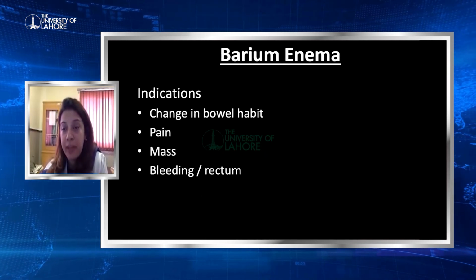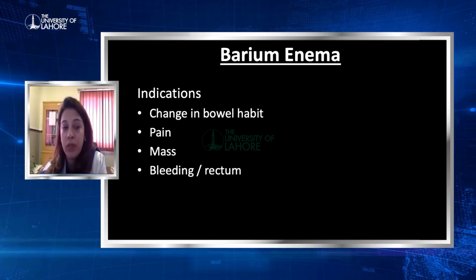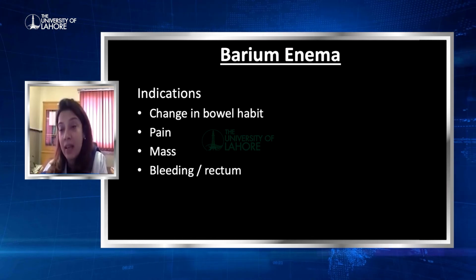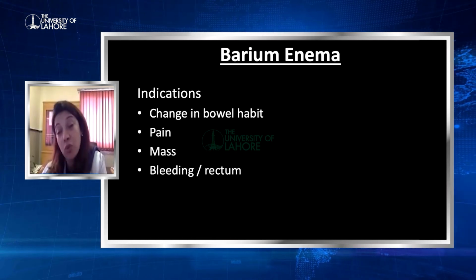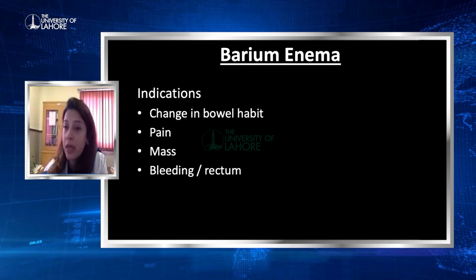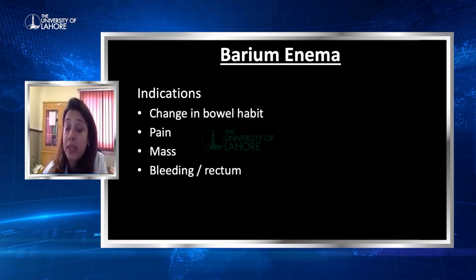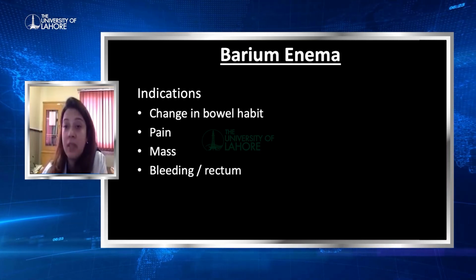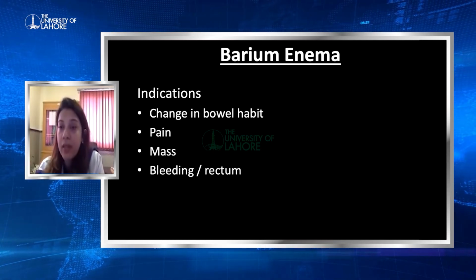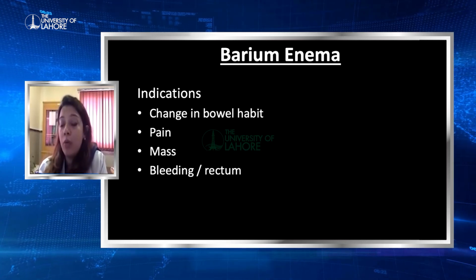So coming to the barium enema, what are the indications? Change in the bowel habit, constipation alternating with diarrhea, if you're suspecting a mass, or if you're having bleeding per rectum. But then again, because of the colonoscopy, it is usually obsolete now. And then we've also got CT scans for a CA of the colon. We would like to do a CT, but especially in Pakistan, there are places where the CT scan facility is not available, and the doctors who are working in those areas, at the district level and the tehsil level and the villages, they should know how barium enema is performed.